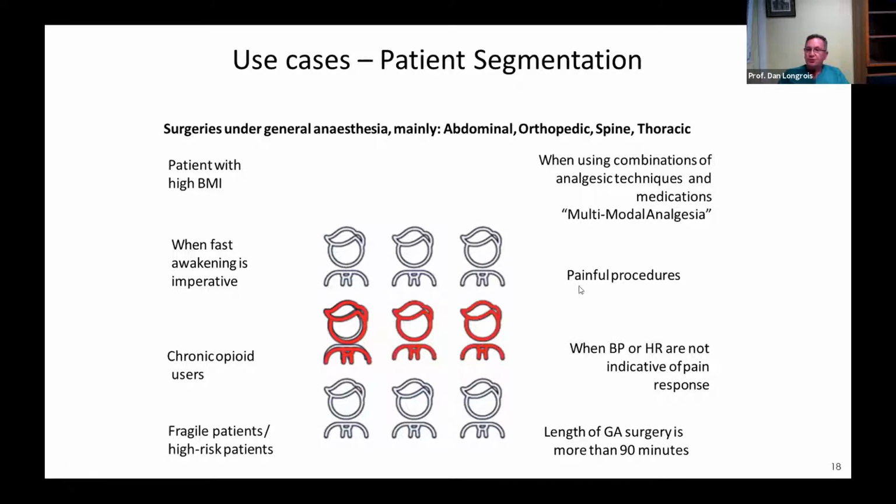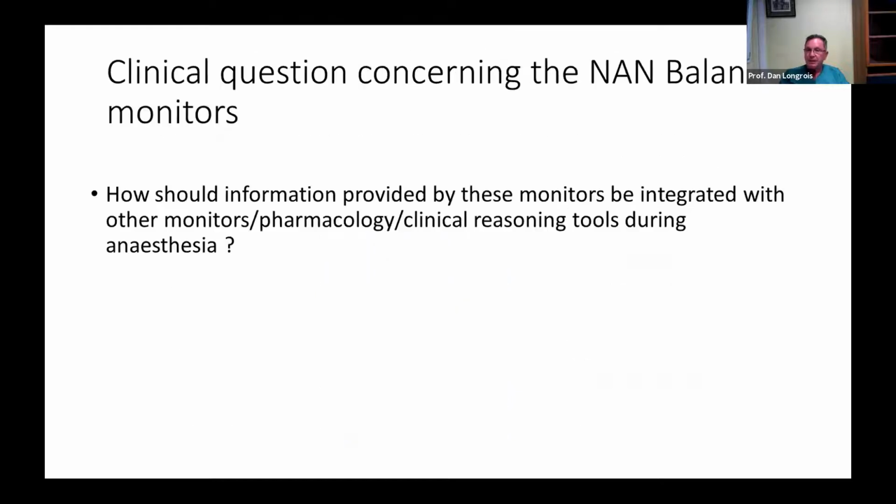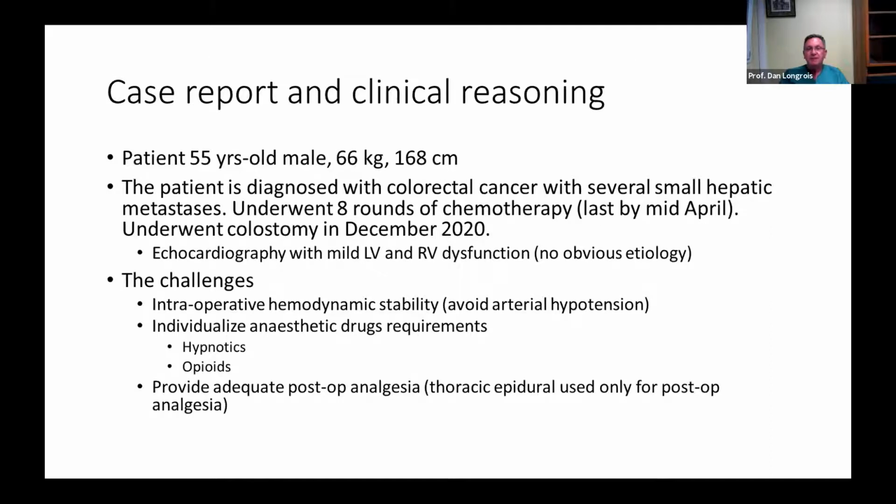Of course you have procedures which are supposed to be painful. Open thoracic surgery can be very painful. Orthopedic surgery can be very, very painful, and lengthy and complex surgery, whatever the specialty, can also be very interesting, and the NOL becomes informative. So the question now is, how do we put together the information provided by so many monitors?